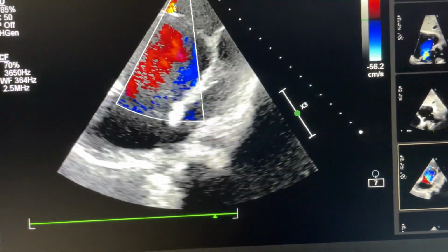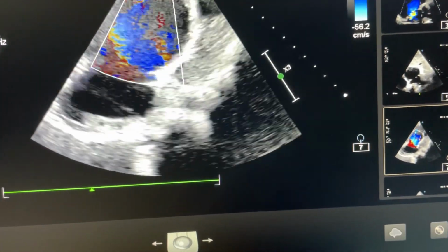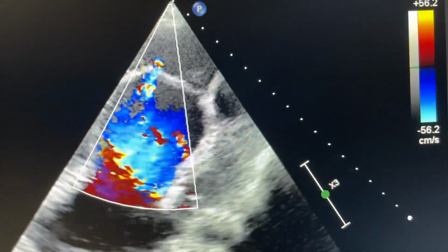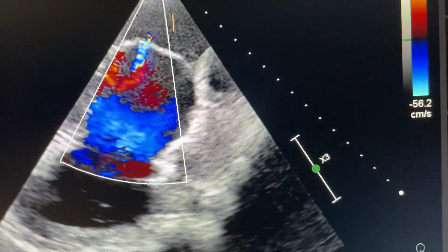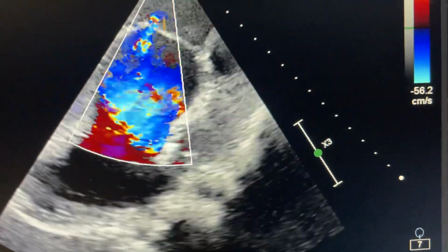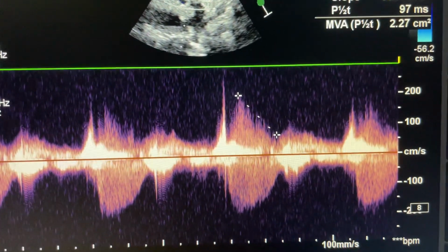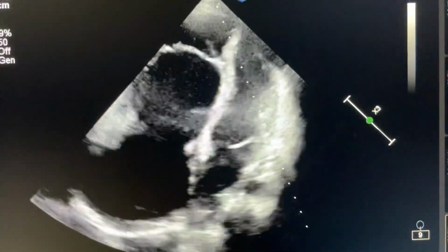Again, next image, you can see here the tricuspid jet is coming. So the jet position is quite close to apex. That you can say low lying TR jet, a feature of Ebstein's anomaly. Velocity across TR is usually low. Again, you see the same thing.